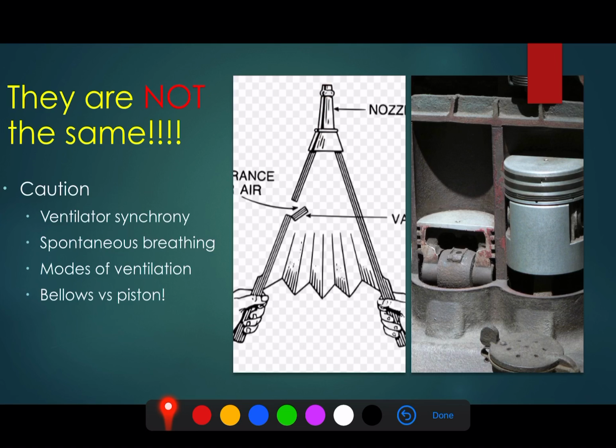Whereas with an ITU ventilator, you're going to guarantee the volume by bringing this piston down each time and therefore actively filling this chamber with gas that can then be expelled out during the inspiration phase of the ventilator.